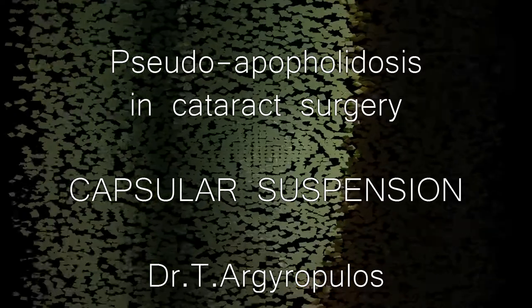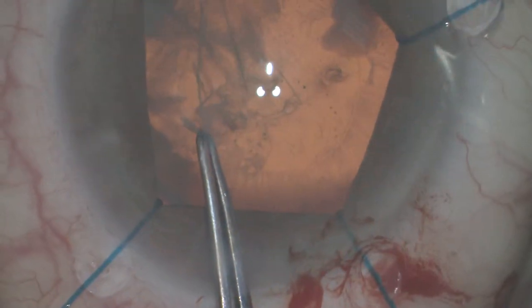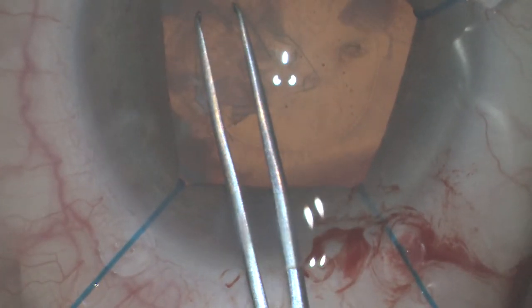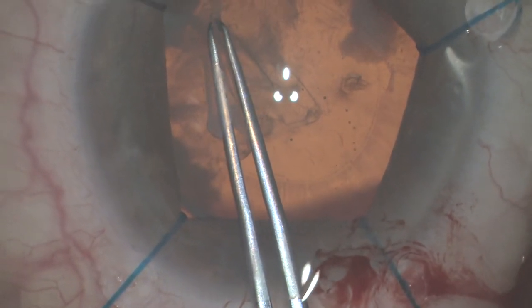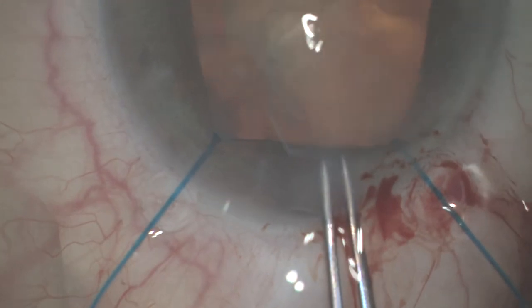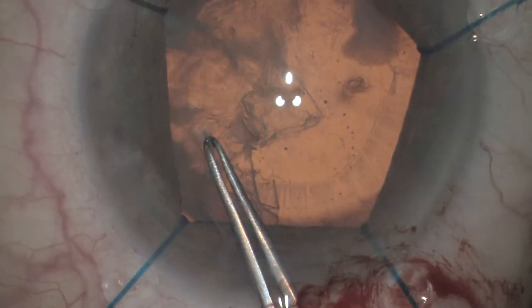The technique of capsular suspension is considered to make a safe cataract procedure in cases with heavy pseudo-exfoliation. This is the phase of capsulorhexis. Note that we pay a lot of attention to make the suitable size of capsulorhexis in order to avoid too much stress.